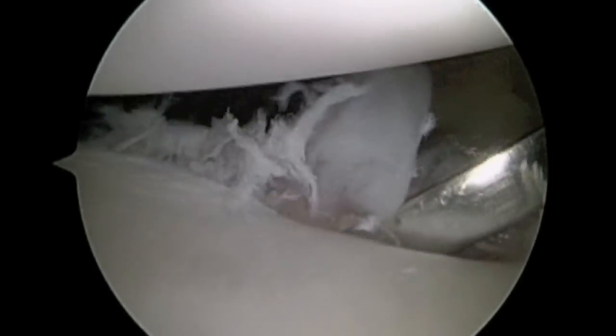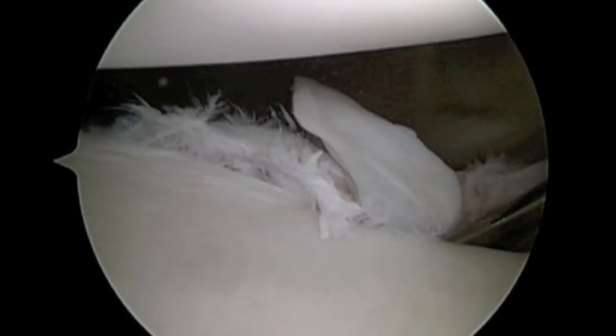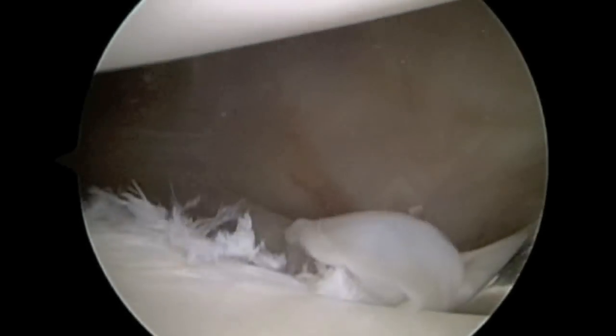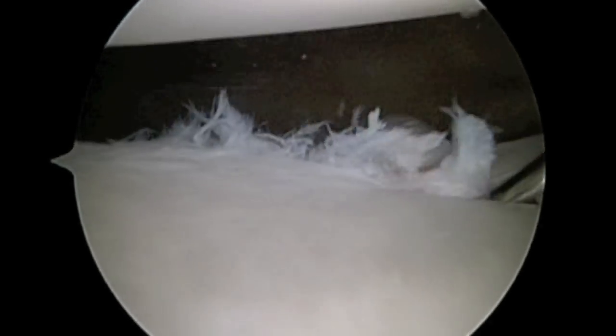An elevator is used to mobilize the labrum and the joint capsule. They have been scarred in a position that's not normal, and this elevator allows us to move the labrum and the capsule back up onto the face of the glenoid where they belong. A rasp is used to help stimulate a healing response along the edge of the glenoid bone.